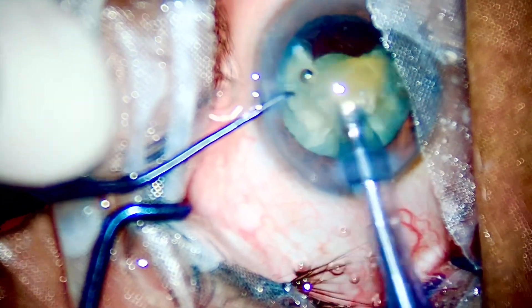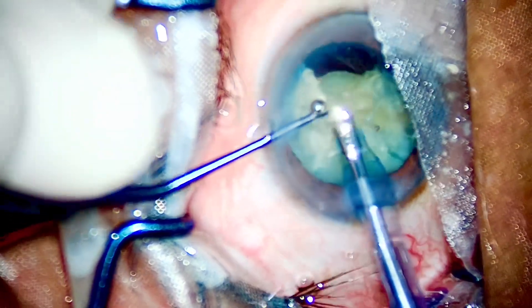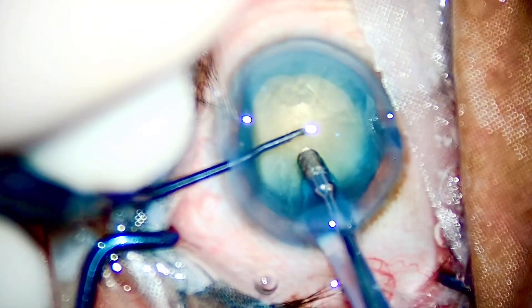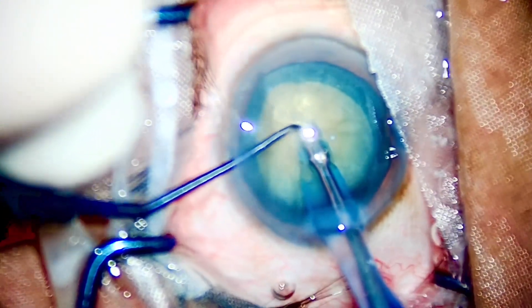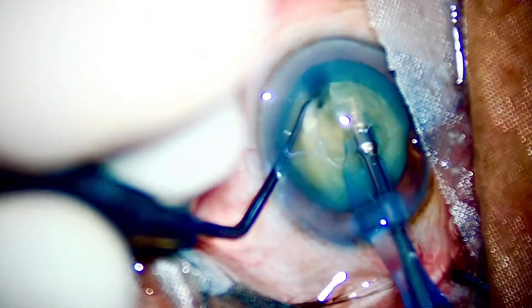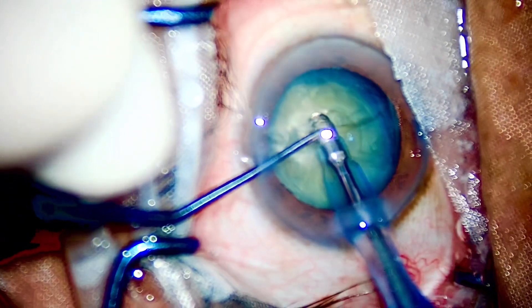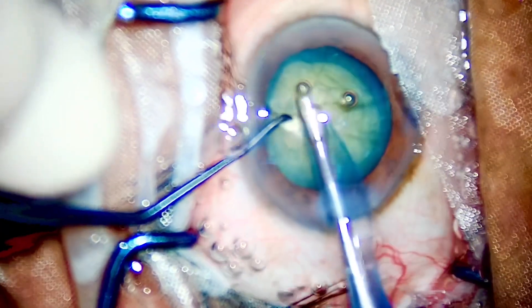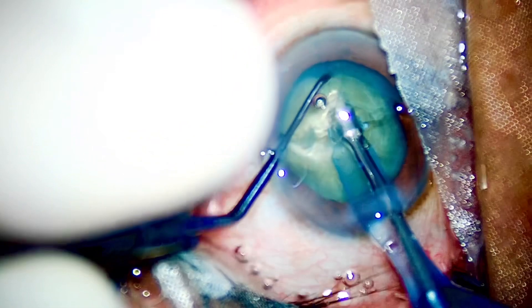Especially the direct chop technique — which is, mind you, the fastest technique to chop a nucleus. Once again, go into the endonucleus bevel down, identify the sweet spot, and play your chopper — just like that. When a chop like that happens, the rest of the case becomes a cakewalk. Air bubbles are irritating me, but nevertheless — once again into the endonucleus and chop.